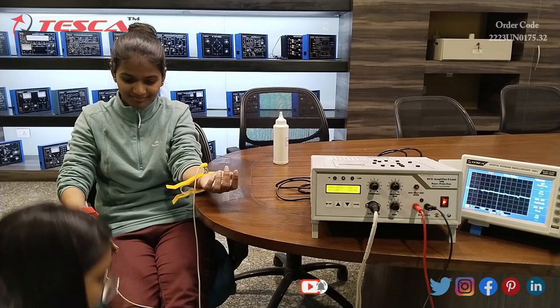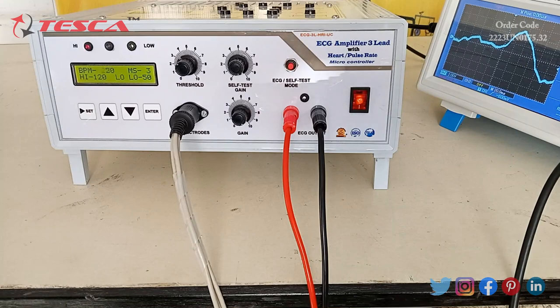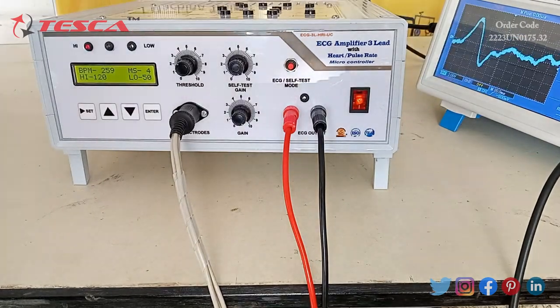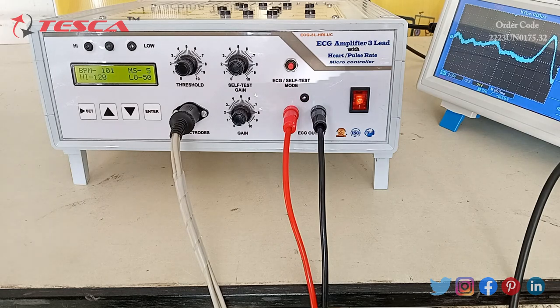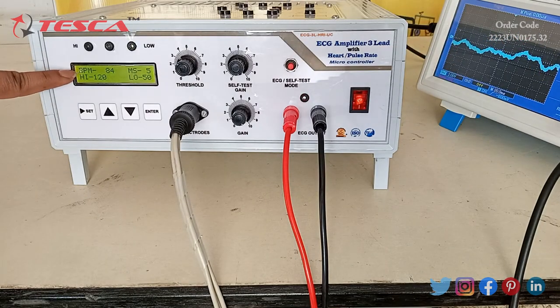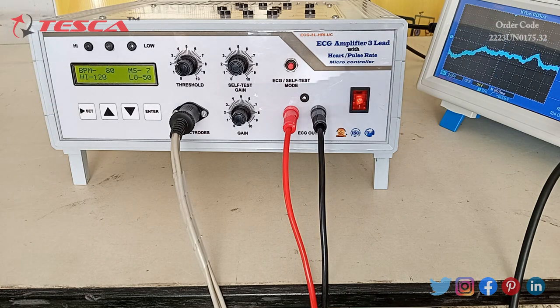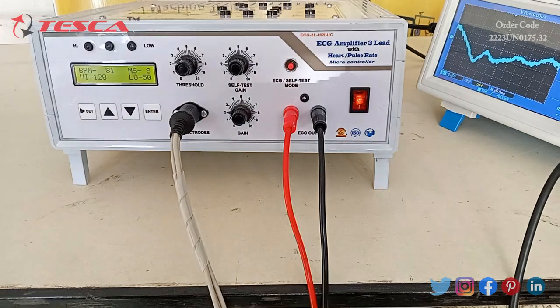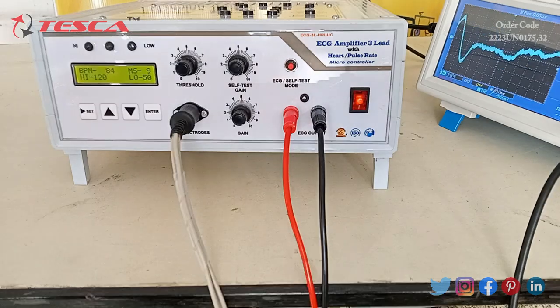Now we will measure the BPM on the trainer. I have connected all the clips to the patient. Now you can see on the display of this apparatus the BPM is showing approximately 84, and the ECG waveform you can see on the DSO display.